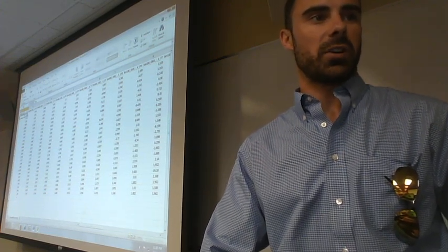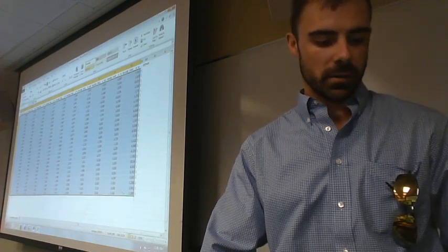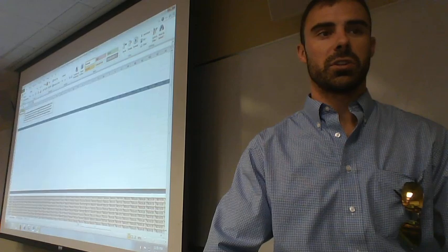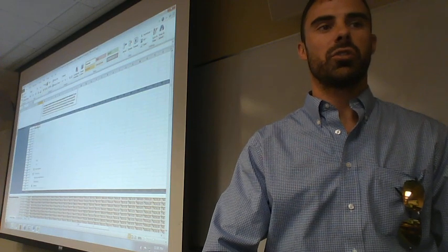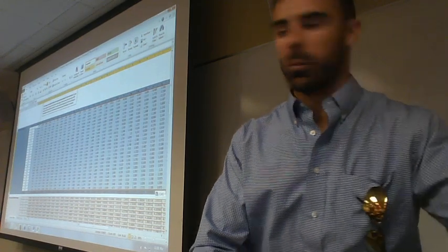So all you do is you highlight all this raw data across our 32 channels, just like that. Control C to copy, and then we're going to come back to our calculator sheet, which is here. Okay. We paste it right where that arrow goes. Cell C12, you can right click and paste. Okay? Now notice that when we did that, all those cells here become numbers.